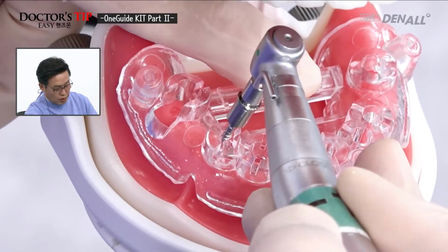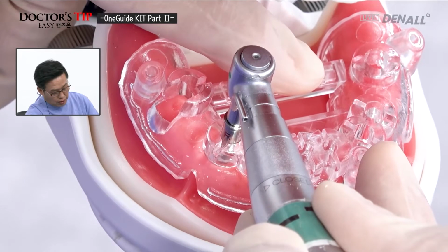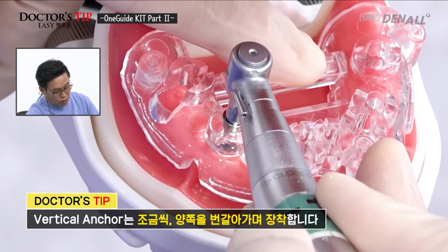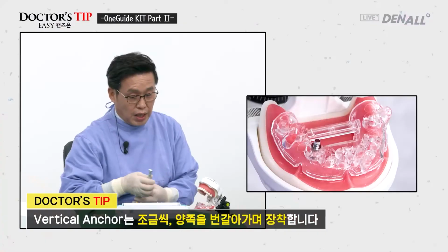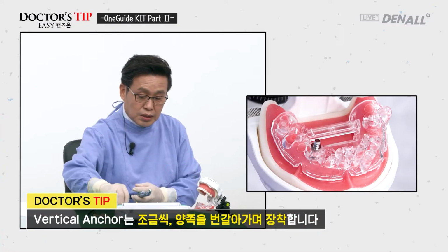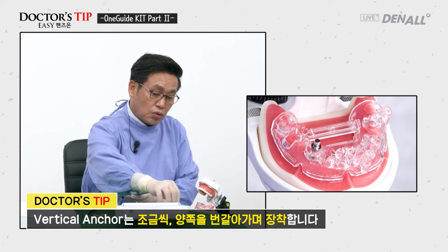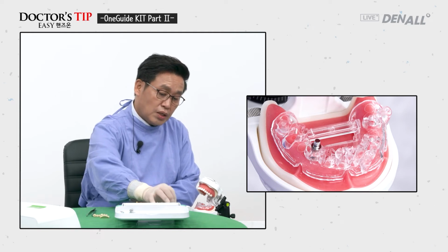If it is drilling mode and it's mounted. The vertical anchor is not mounted to the fullest. Do a little bit and I'm going to do the other side. This is so that stent is not tilted and is fixated well. As you can see, drilling is done.